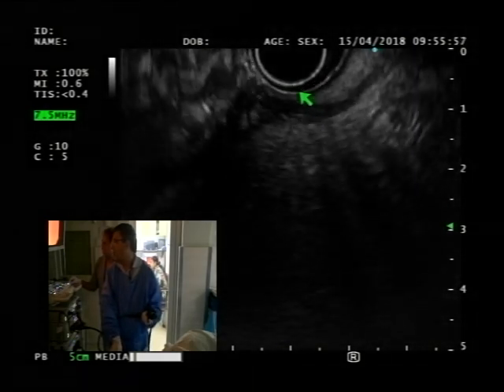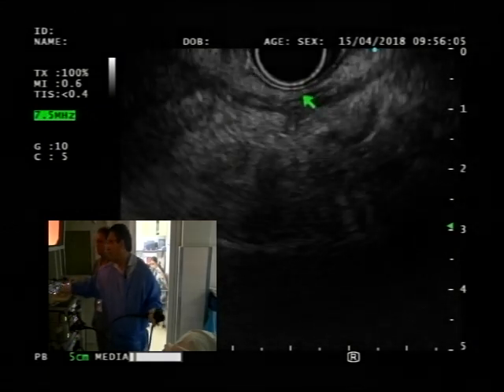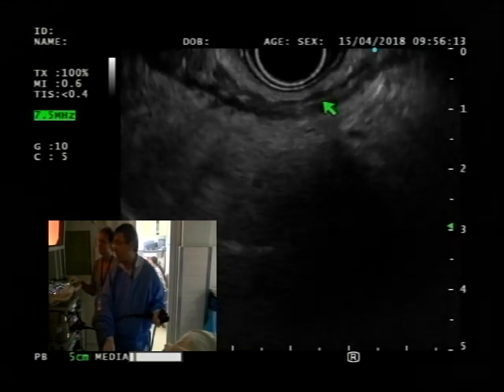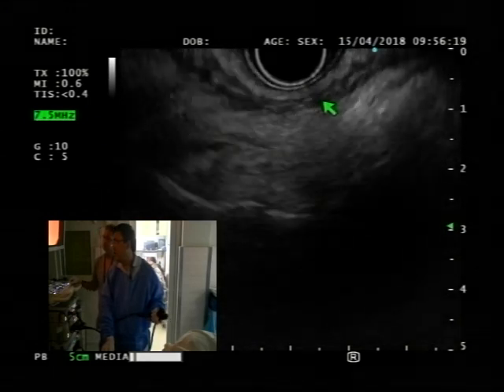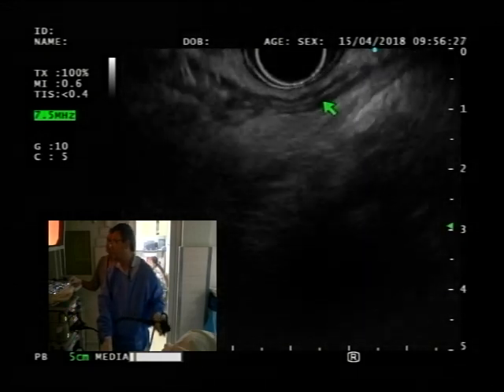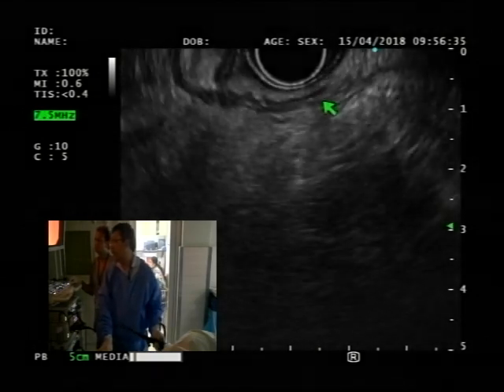So here, I think this may be the area. Yeah, that's what I was saying, this particular area that we are seeing, and it's on the anterior wall towards the bladder area. So I think that's the area, but it's not really a cancer. Yeah, but still, that would go clearly by the fact that she's undergone treatment. I don't see really a cancer right there. So to me it looks fine. Okay. What I'll say is probably some post chemo changes, a little bit of thickening, but no actual mass seen.